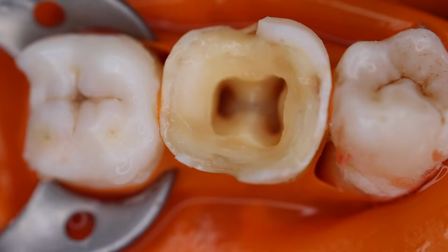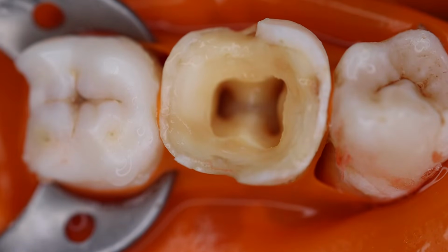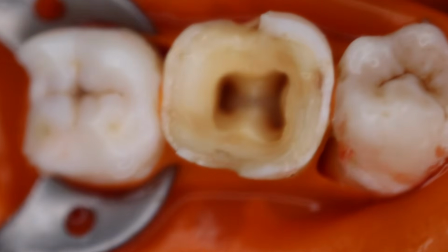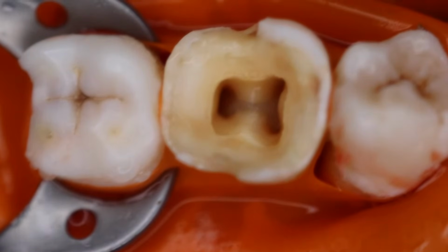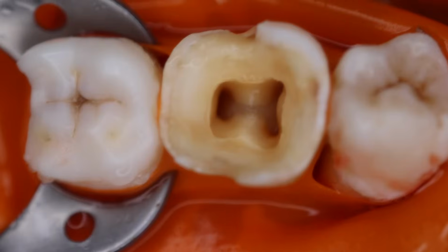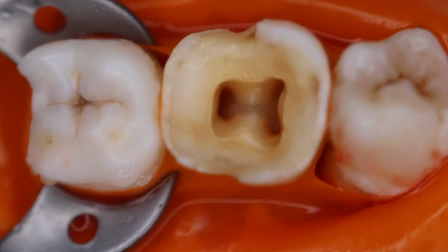So this is how our access cavity would look like once we have identified it. Now for the next step, we are going to move on to the identification that we have already done. So we would next determine the working length. Before that, an initial approach that we can follow is we can just use a negotiating file like a 10K file or a 15K file.